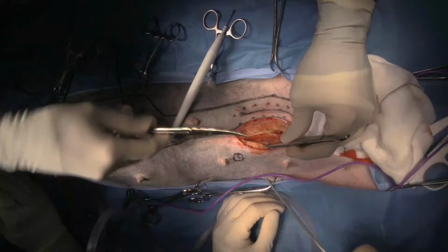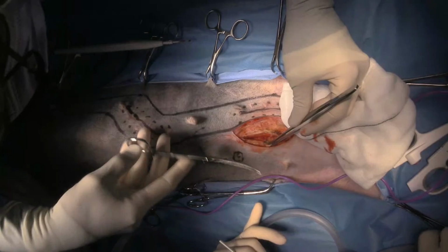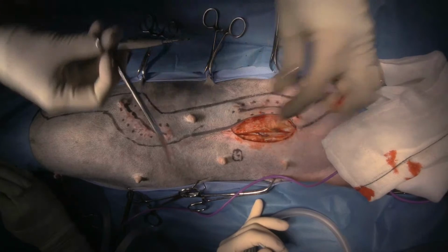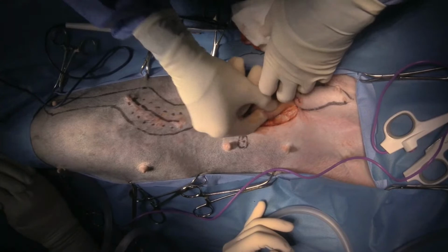Piyush has asked why you're removing just one side mammary gland chain. That's a good question. Normally in cats we do bilateral strips and in dogs we just do unilateral. Now the difference with this one is that there is a tumor on the opposite side, but we're going to send it off and see if it comes back malignant. If it comes back malignant, we probably are going to recommend doing the other side as well. The problem in dogs is that they don't have as much skin as cats, so in cats you can do both sides at the same time, whereas in dogs, you have to do one side and then the other.